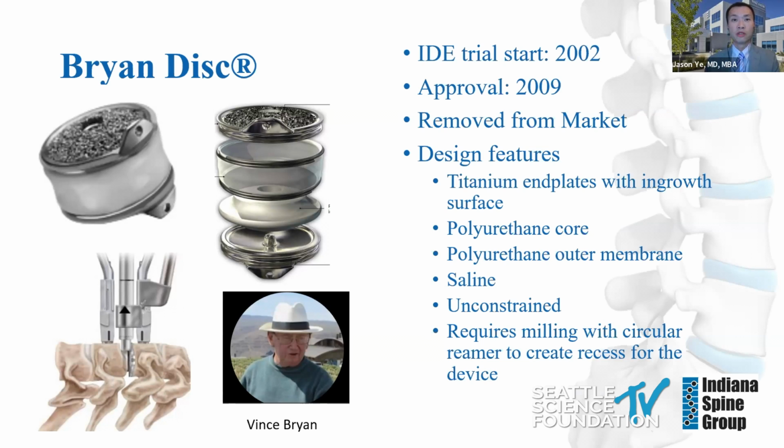The Bryan was approved in 2009. After initial success, it was eventually taken off the market. Rumor was one of the component manufacturers went out of business, but sounds like Tony is going to bring it back. So that's great news.